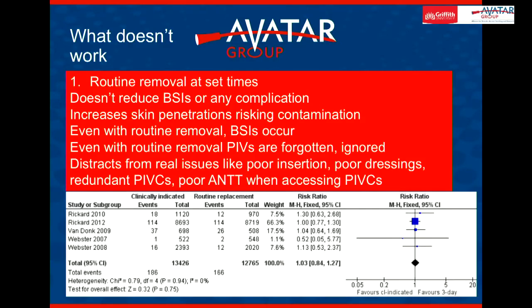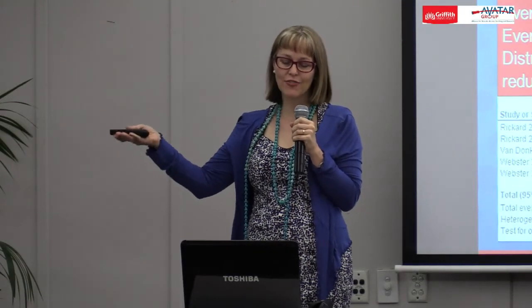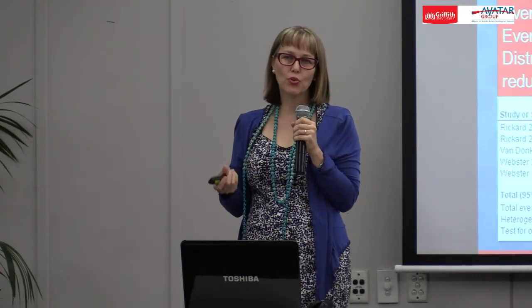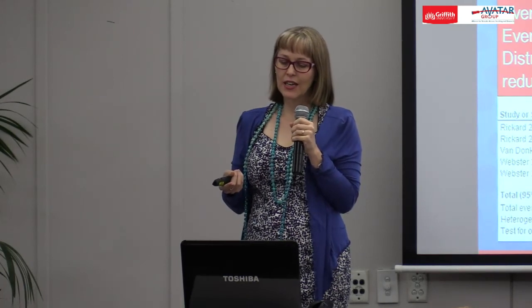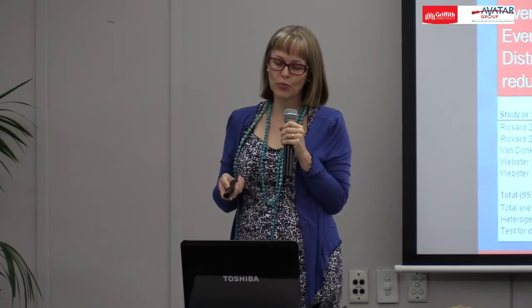But unfortunately, I think that breeds this. We know it doesn't. I mean, there's many PIVs that are left in now. And I think it's a distraction. If the problem is redundant catheters, let's think of interventions to target redundant catheters rather than relying on some other policy that's unrelated to try and save us. Similarly, if the infection risk is the poor dressings, which we know it is, poor decontamination, poor ANTT, or poor insertion, then we need to target what the actual problem is.